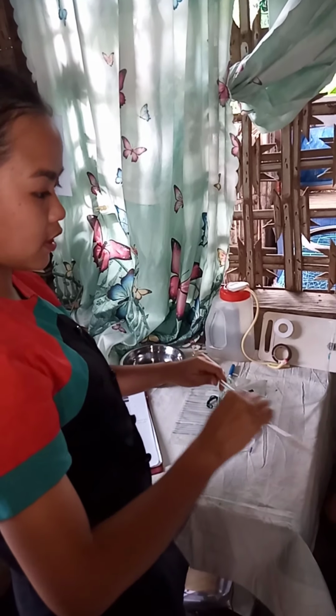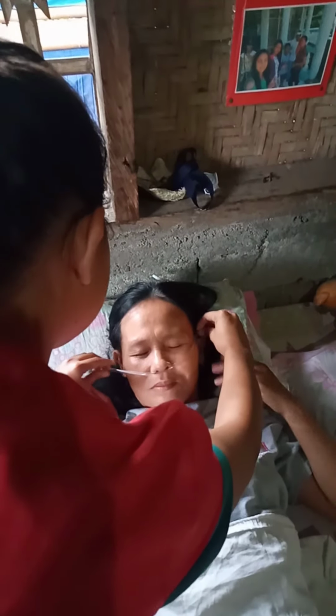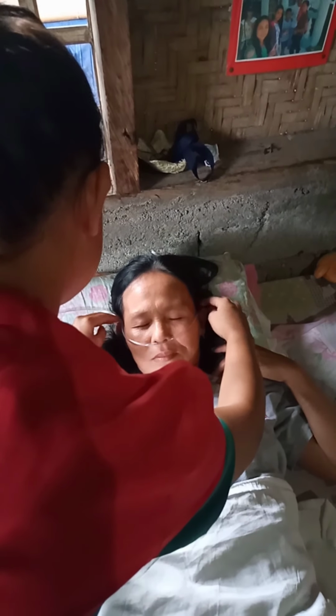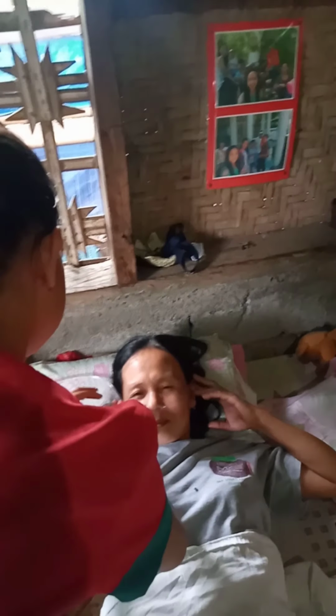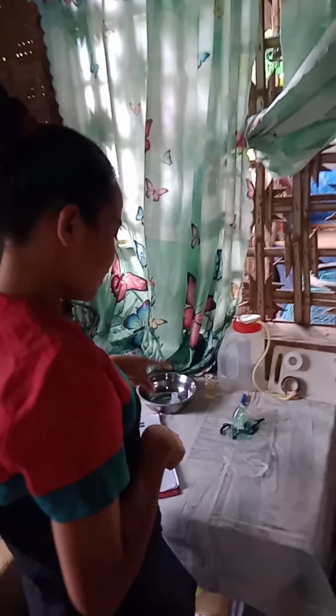Then place these nasal prongs in the patient's nostrils. So that's for nasal prongs. Next, we go to the face mask.